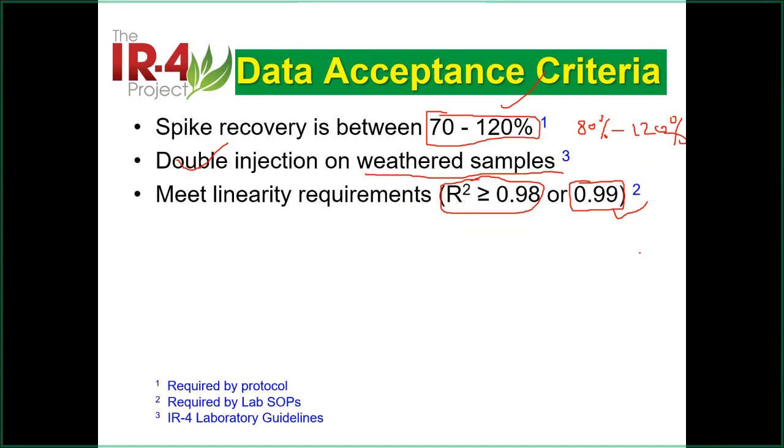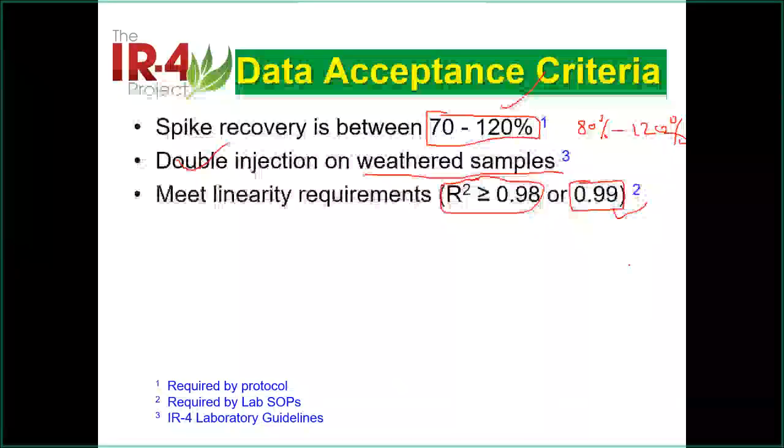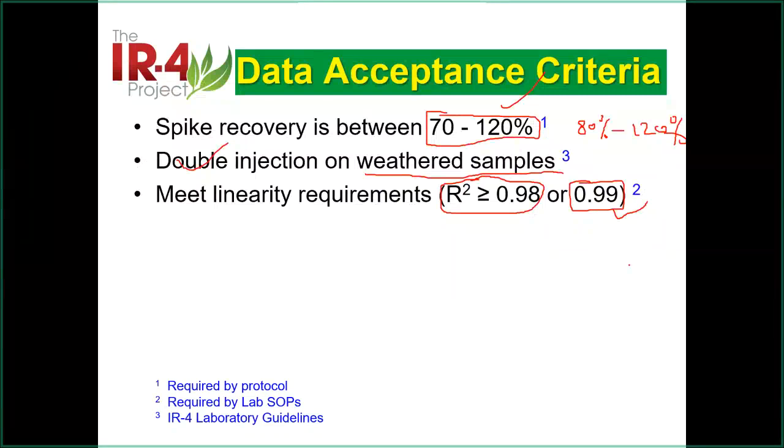But for the residue study for MRL, it should follow the requirement of the method, and always talk to the study director about whether you can use a different internal standard. I say that short: most likely this does not apply. So you do not have that choice.